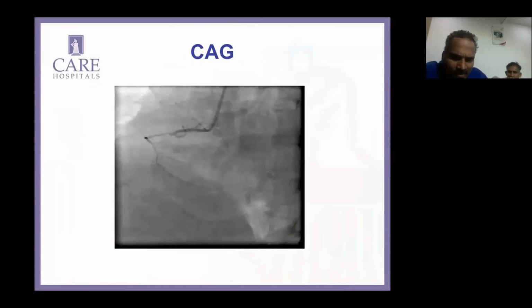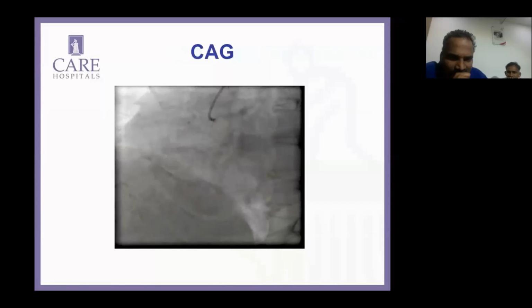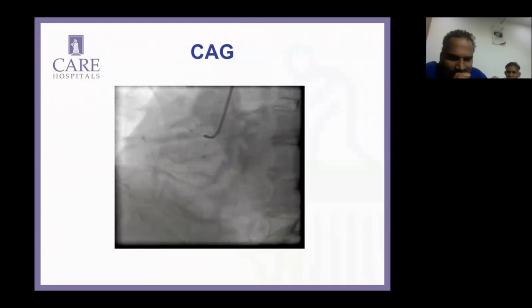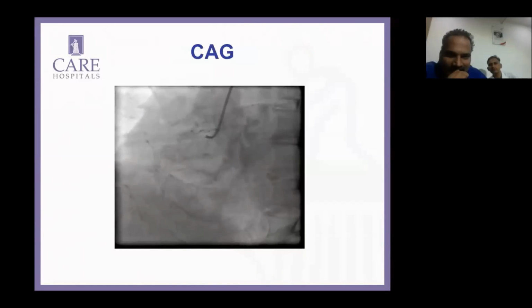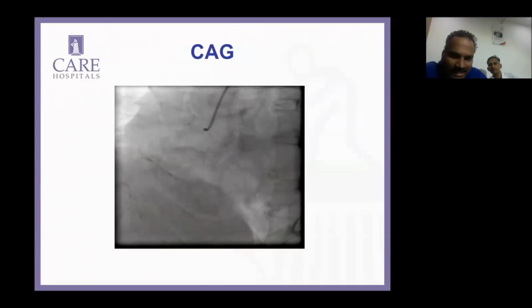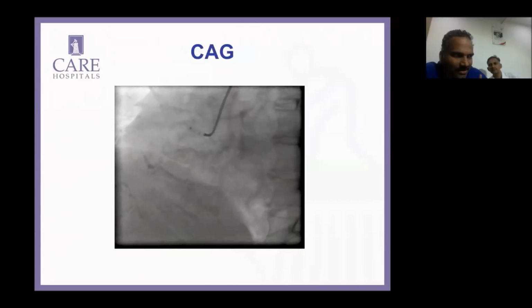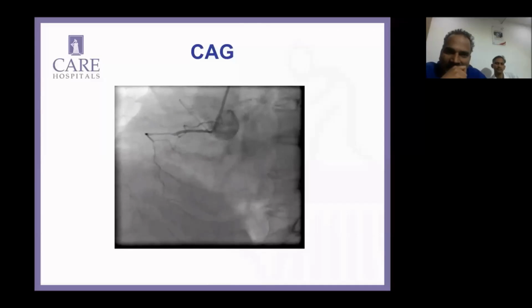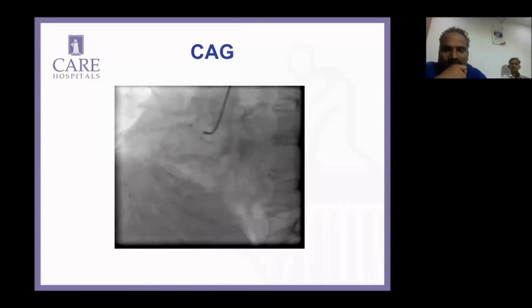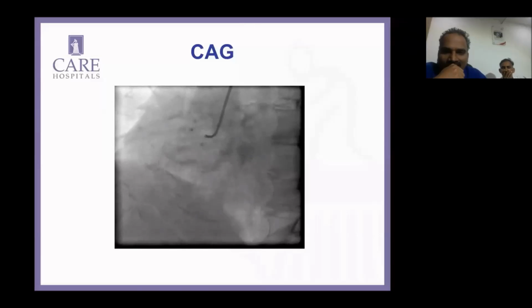I felt the branching is there at the site of total occlusion. Yes, there is. But when you see CT angio, surprisingly, there is a good vessel. Here it is looking like a blunt occlusion. So if I take this CTO scoring, I'll push this patient into a blunt occlusion. But when we see CT angio, there is a good flow. Yes, that discrepancy we have been having.